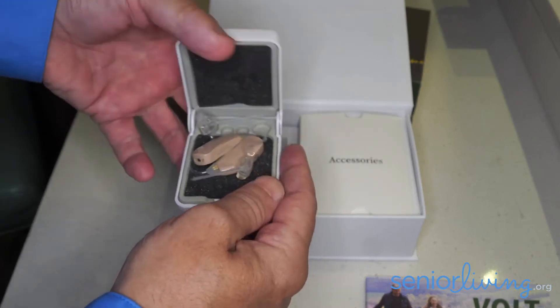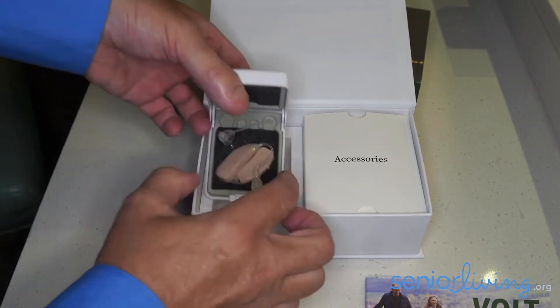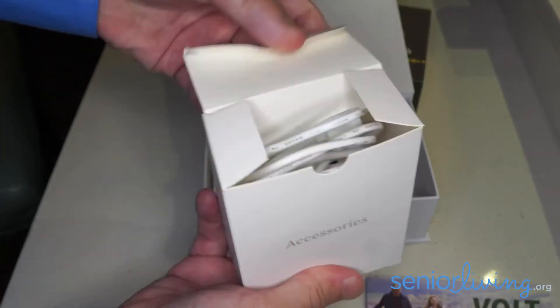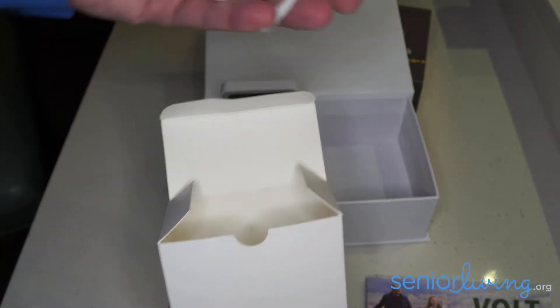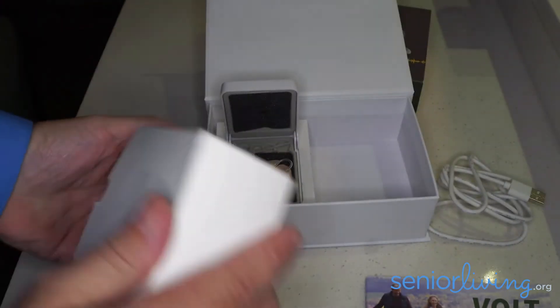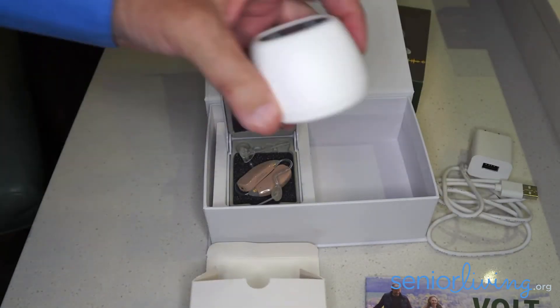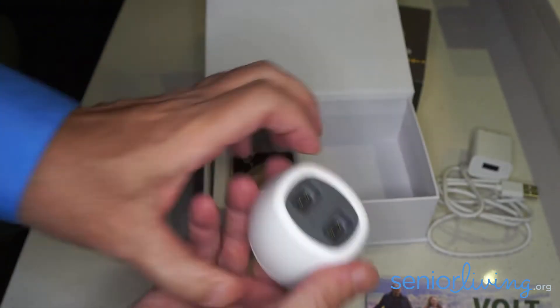That's going to need to be cleaned, and we're going to get to that in just a second. If I look in this little box marked accessories, in here I'm going to find a USB cable, a power adapter, and the actual charging base for the hearing aids.